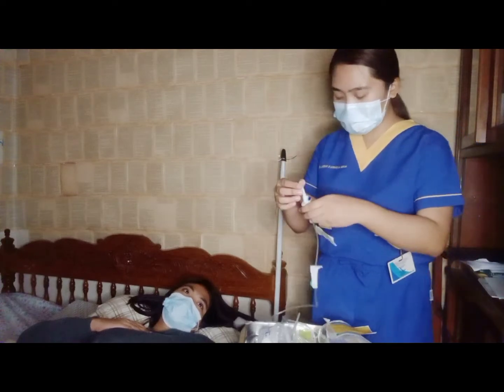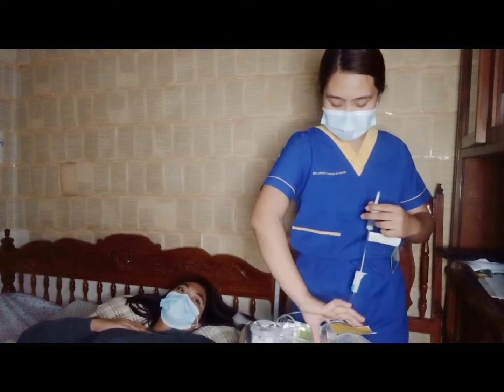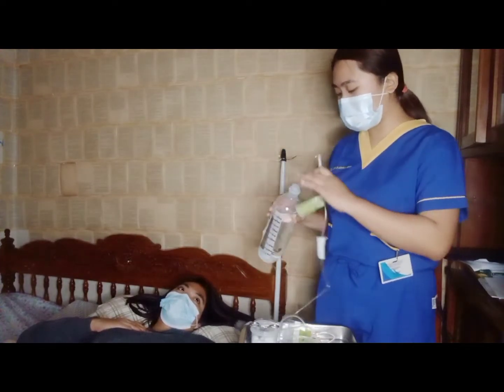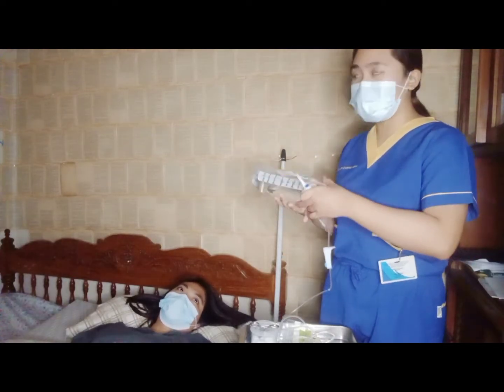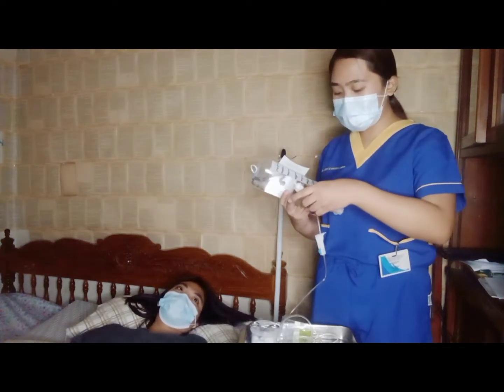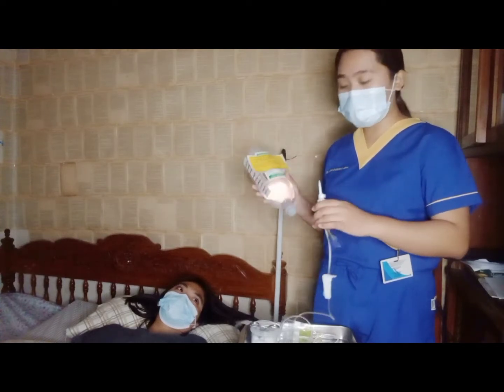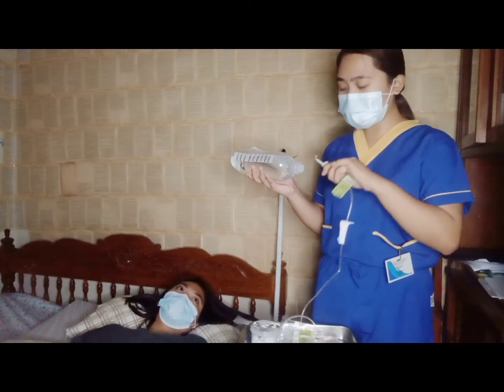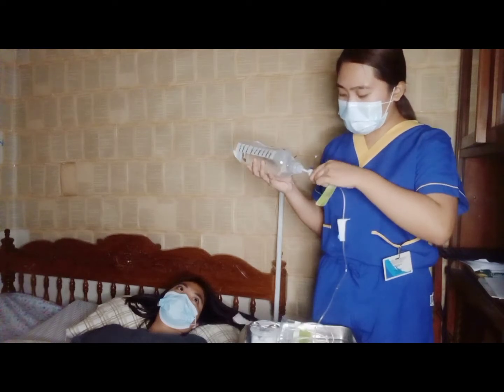Then, we will remove the cap of the spike. Let's hold the IV container inverted. Avoid touching the entry site to avoid contamination. Because if the IV set or the IV solution becomes contaminated, we need to discard it and get a new IV set and IV solution. So, we will insert the spike at the entry site using a pushing and twisting motion.